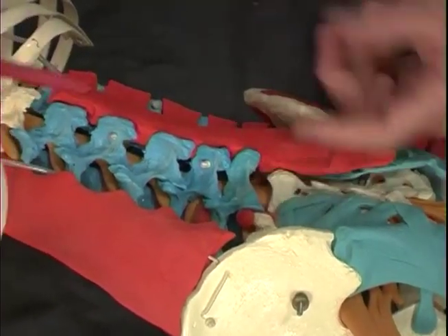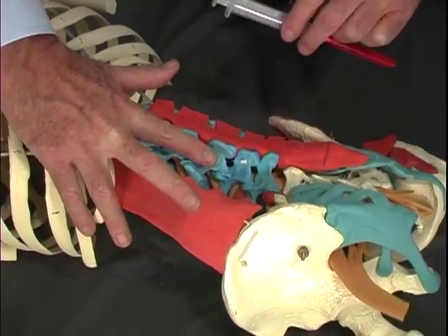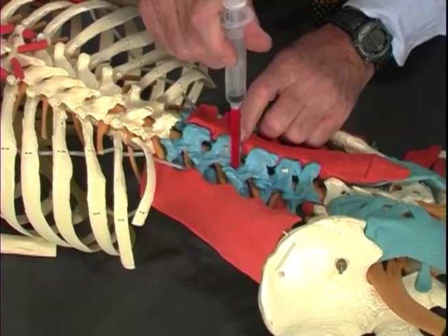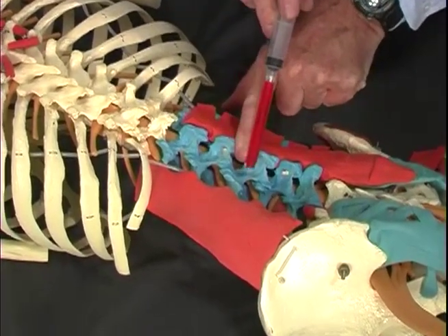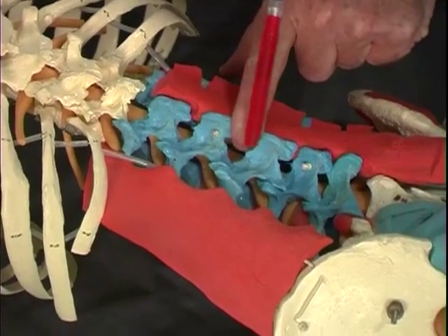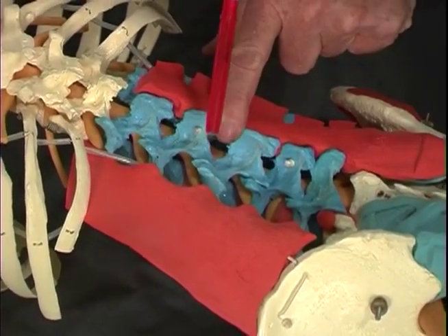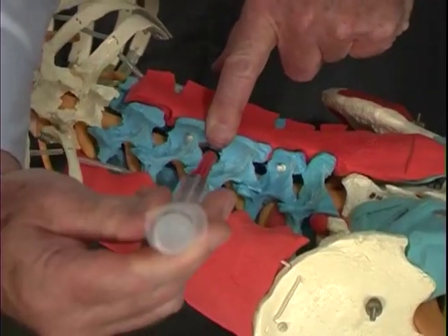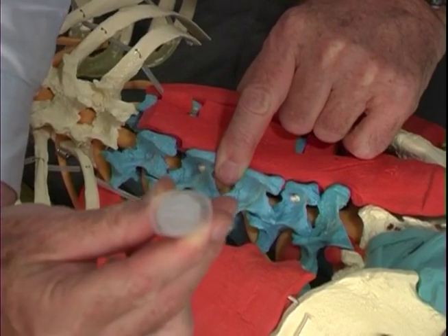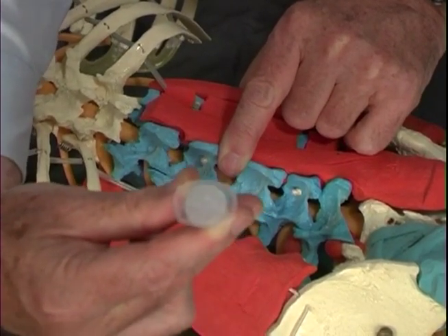Our second line of injections, as we mentioned, are a finger breadth off of the spinous processes, and we're injecting down onto the facet area, keeping in mind that generally the facets line up with the space between the spinous processes, so that by coming down in a straight down direction, or perhaps a little medial angulation, we're hitting that capsule around the joint.